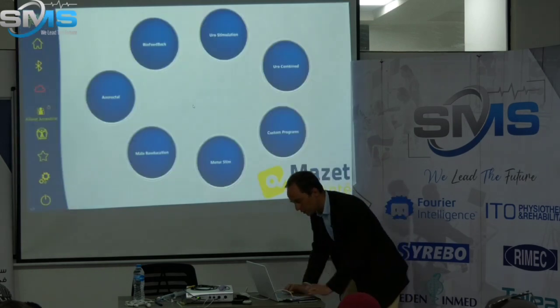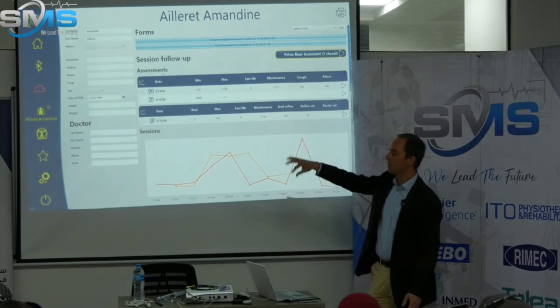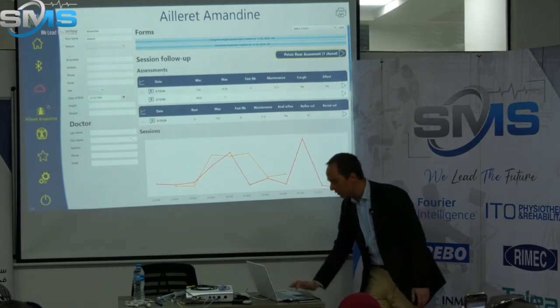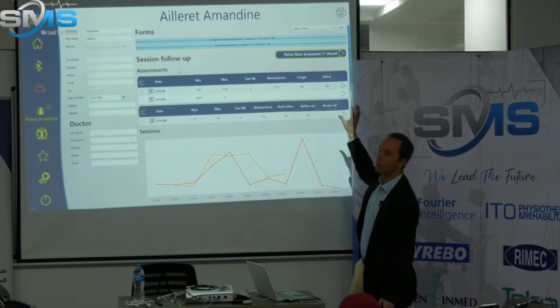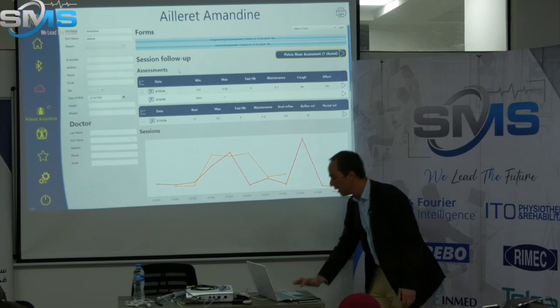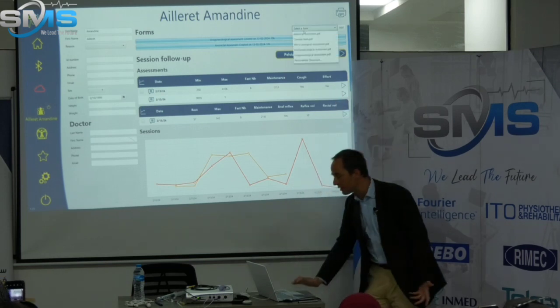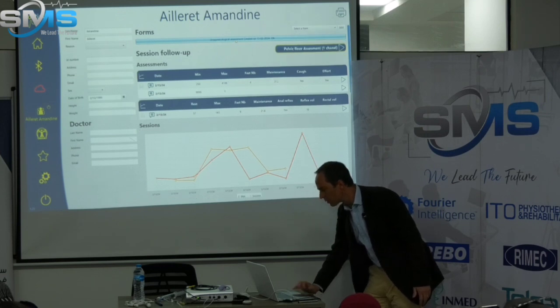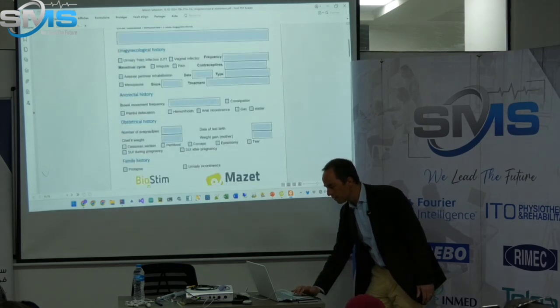So if I just switch here and go here. Here is a device that can help you with different techniques. First, we have patient files where we collect all the data for this patient. The first thing we do here is select the kind of assessment we want to do. So here it was just a trial this morning, but okay, that's the form you saw.